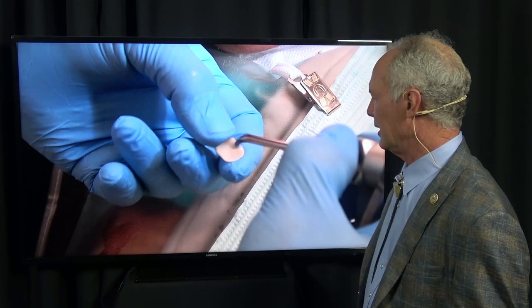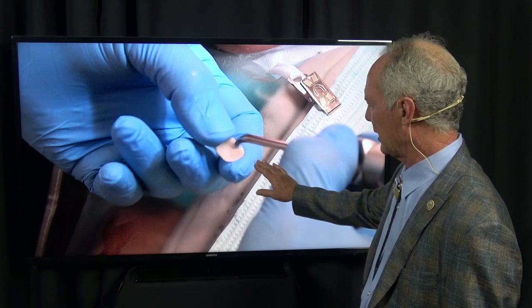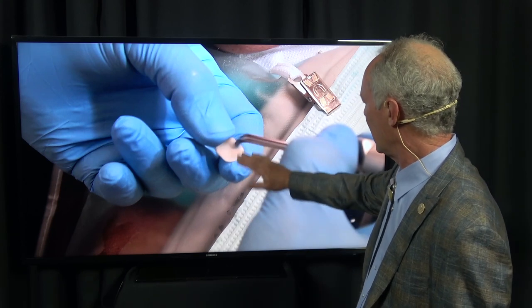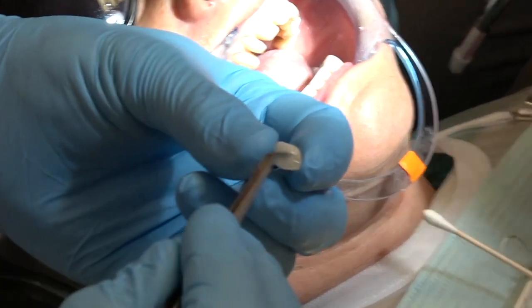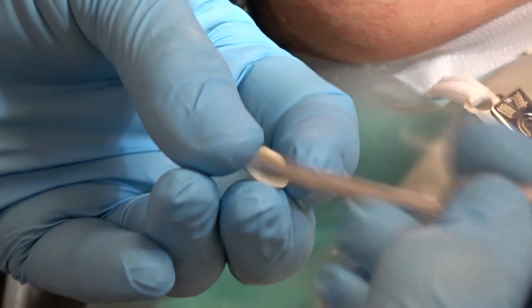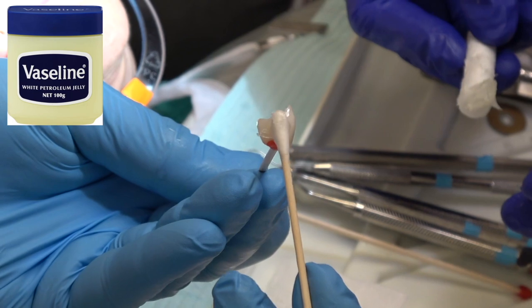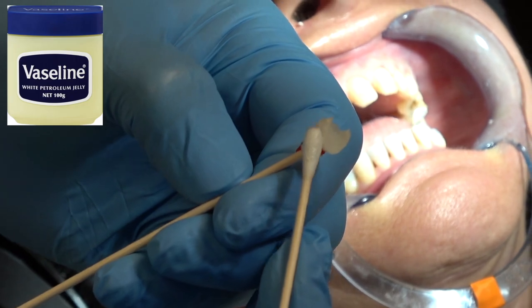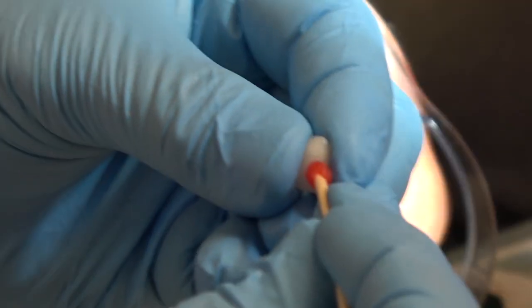These veneers and crowns have been treated with the system you use to treat lithium disilicate Emax restorations - you can refer to that link. Once I've tried them on the teeth, I'm going to wipe the tooth side of the veneer and crown with isopropyl alcohol. Then I'm going to use this carrier and place Vaseline on the interproximal contacts. That keeps the cement from setting up and sticking interproximally, making it much easier to remove the cement.